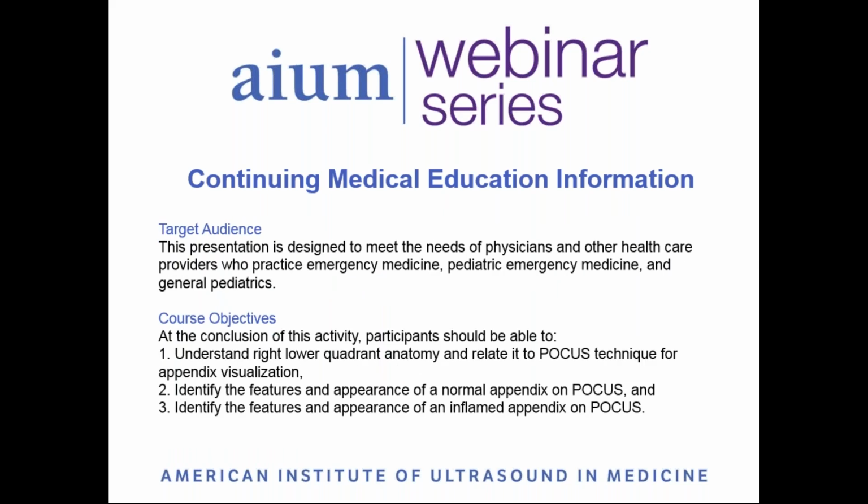By the conclusion of this webinar, participants should be able to understand right lower quadrant anatomy and relate it to point-of-care ultrasound technique for appendix visualization, identify the features and appearance of a normal appendix on point-of-care ultrasound, and identify the features and appearance of an inflamed appendix on point-of-care ultrasound.